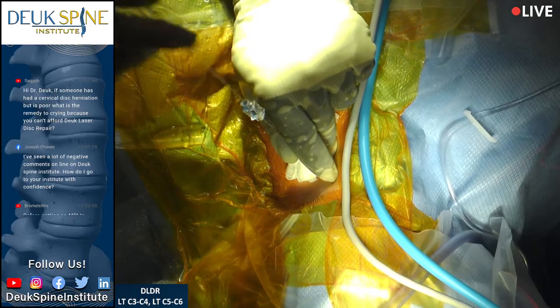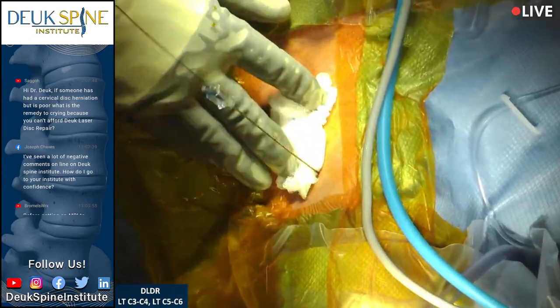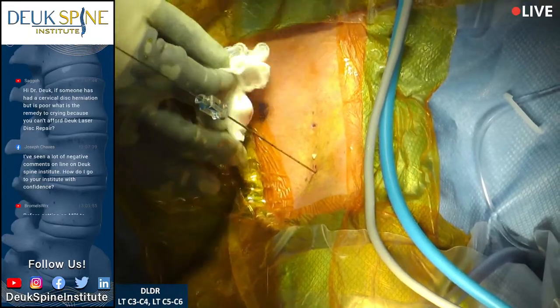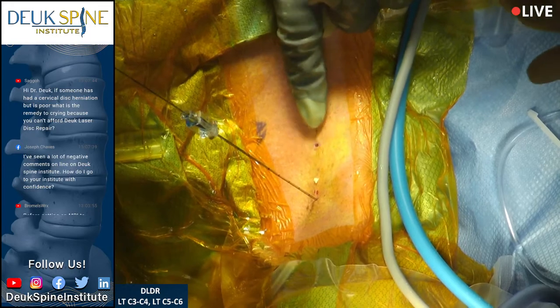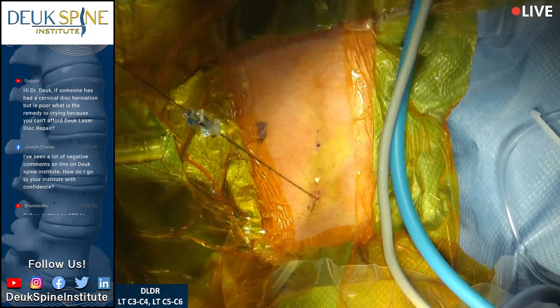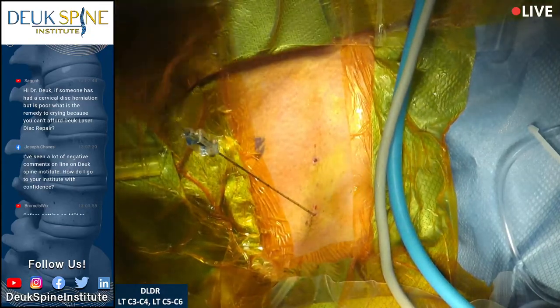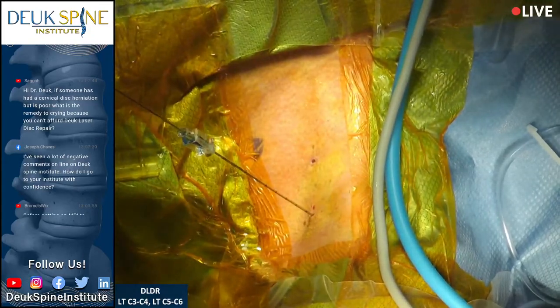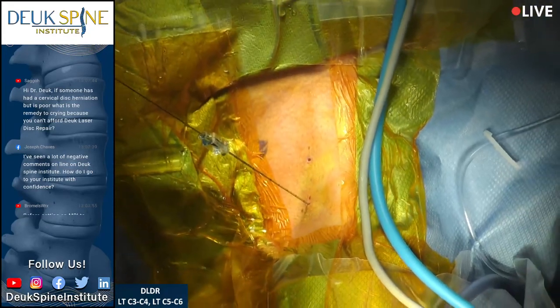We've taken the tube out at 5-6 — there's the incision. It almost looks like a biopsy incision — just four millimeters. No bleeding. His neck is supple. This is the future of spine surgery, folks — you're seeing it right now today.